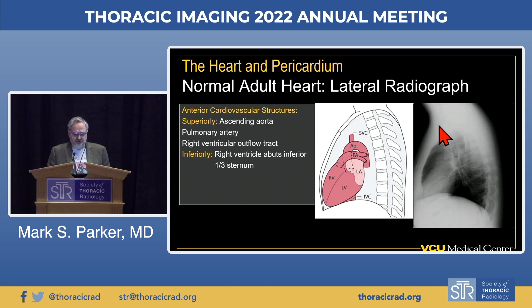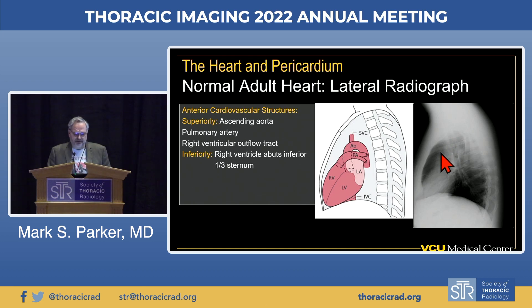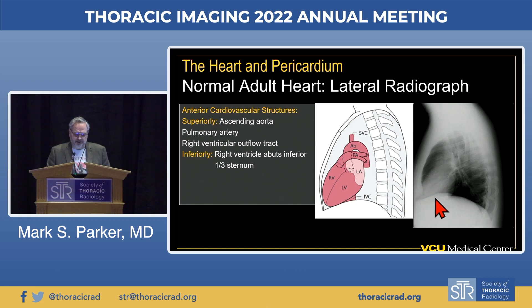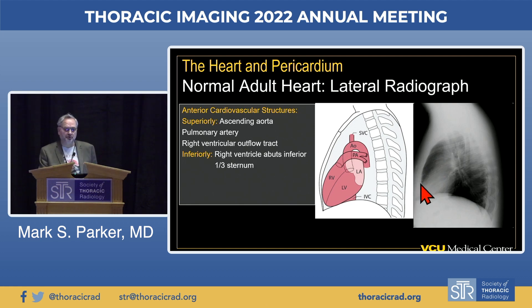Correlating the illustration with the radiograph, the upper border of the anterior cardiovascular structures is created by the ascending and transverse aorta, then the pulmonary outflow tract, pulmonary artery, right ventricular outflow tract, and then the right ventricle itself, which comes all the way down to touch the diaphragm, occupying the inferior one-third of the sternum. Behind the sternum, the upper two-thirds is lucent and the inferior one-third is opaque—this is the normal retrosternal clear space relationship.